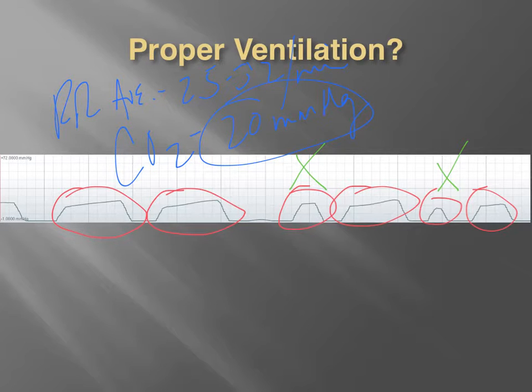Now, as we cover later, hypercarbia is actually just as bad. So if we are hypoventilating a patient either by not providing an adequate rate or an adequate tidal volume, we can actually cause just as much damage to the patient, though the blood flow to the brain then is actually increased. However, with carbon dioxide, there's so much acid in that blood that we're not able to circulate it off through the lungs, and then oxygen isn't moving through the alveoli as well with all the carbon dioxide.